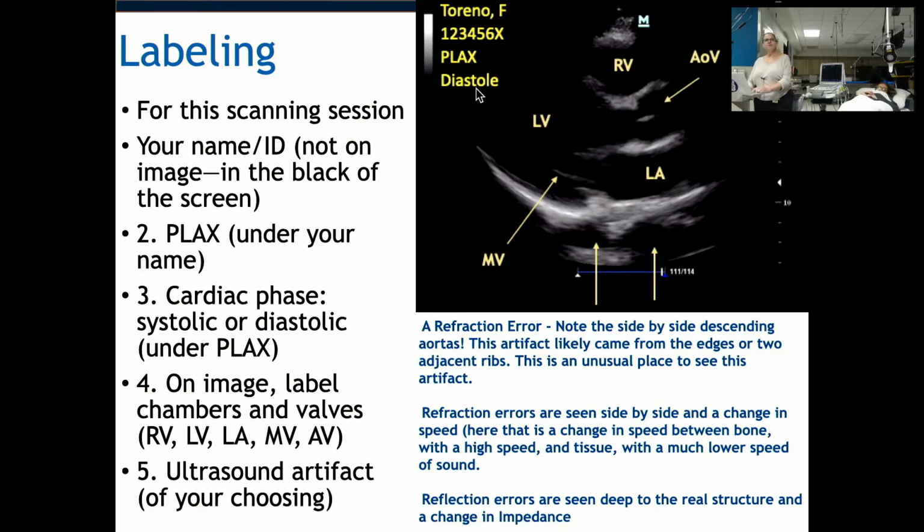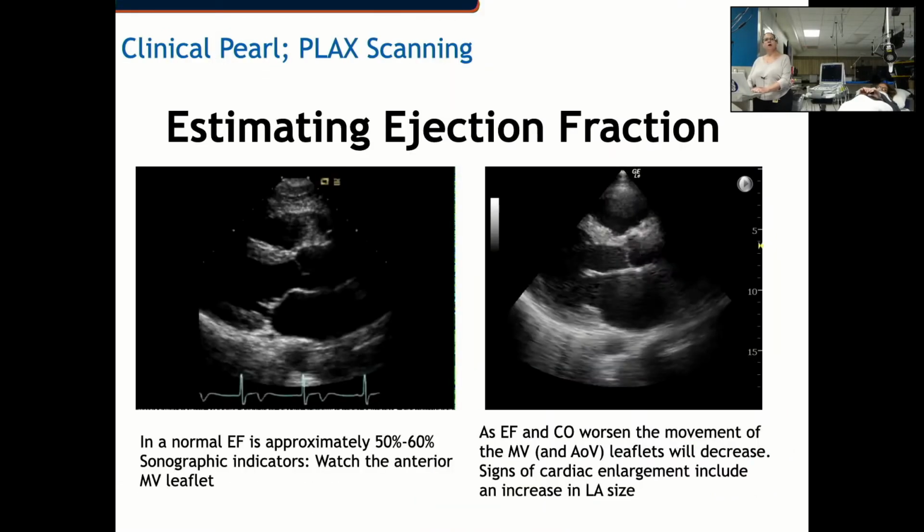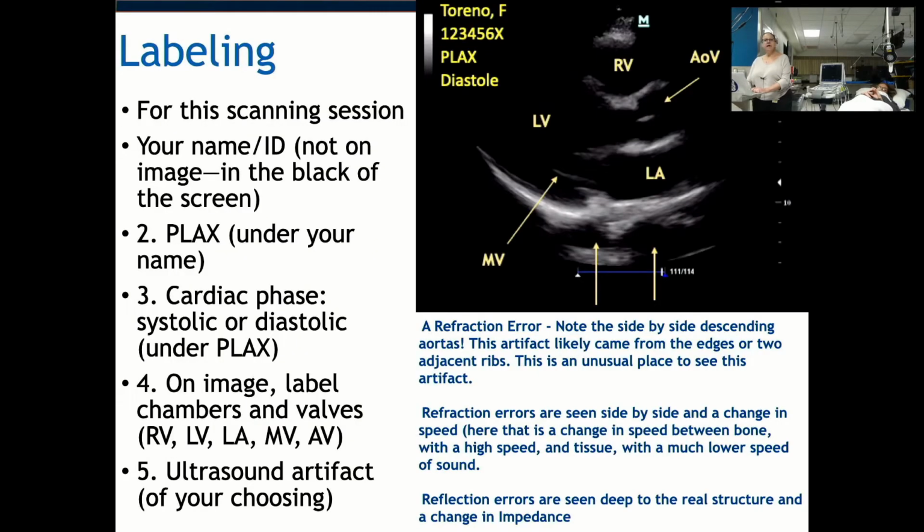So make sure you have that anatomy labeled. And then often for a lab, there's going to be some other anatomical items that are addressed, and these you can place either on top of the image or just off to the side of the anatomy and use an arrow.